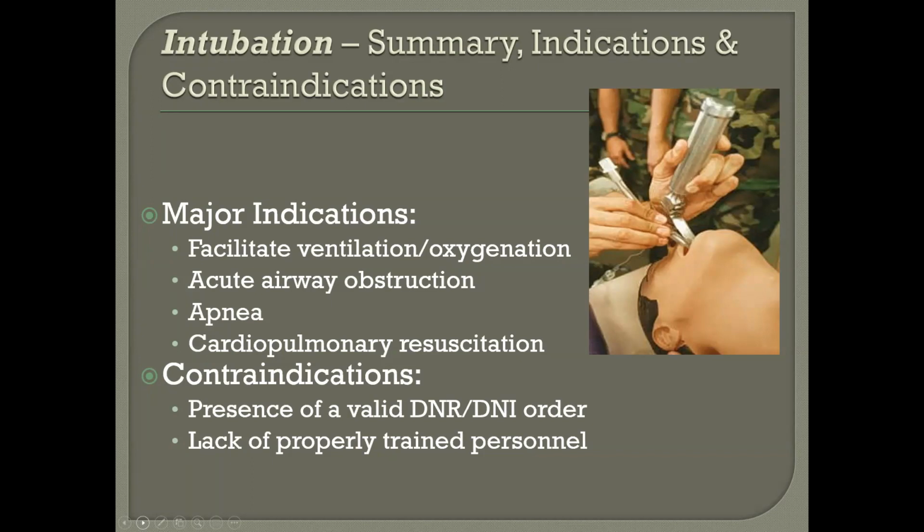So we had this sidebar conversation: if that's what you want in an emergency, and it's an outpatient setting, basically at a cardiologist's office, then you really need to have an entire intubation box, including suction, including Ambu bags, and end-tidal CO2 detector devices and things along those lines. So it's trained personnel. It's also the proper equipment.